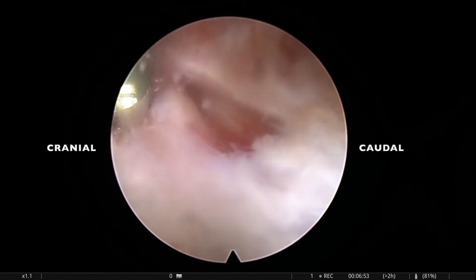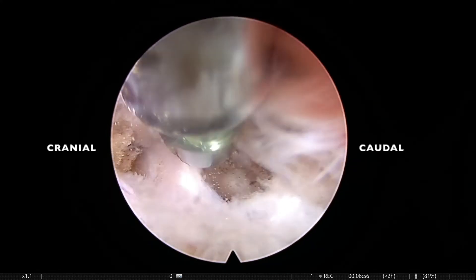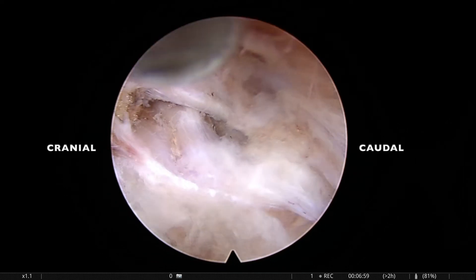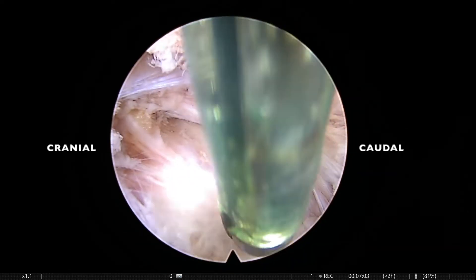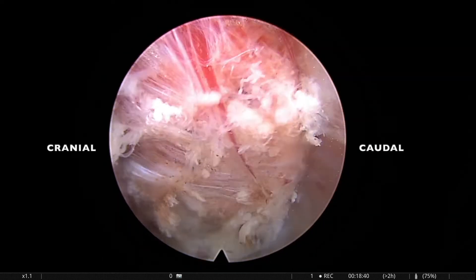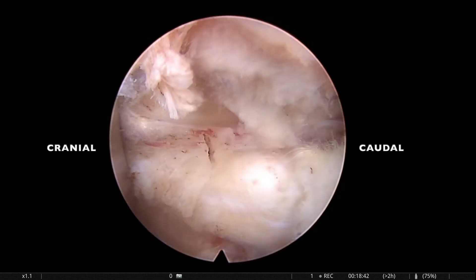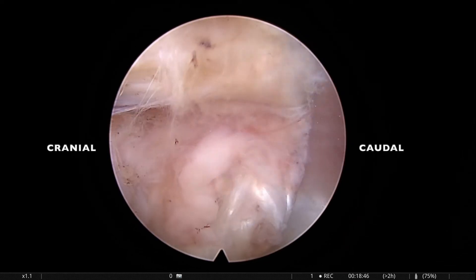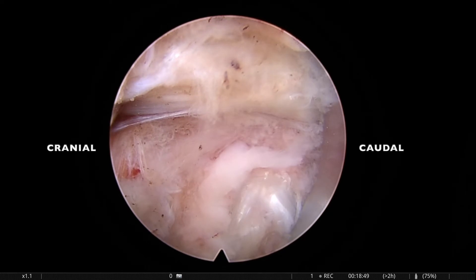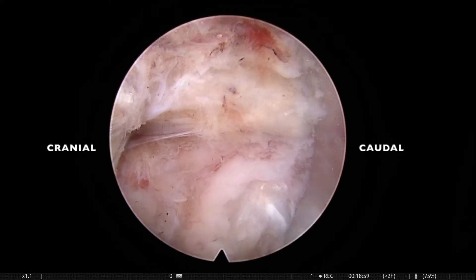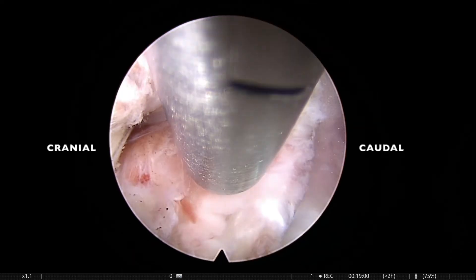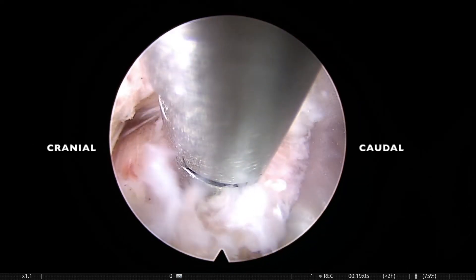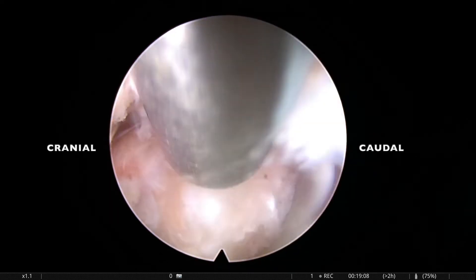After hemostasis using either a dissector or a hook, further fragments are searched. To orient ourselves, the exiting root is between the 9 o'clock and 6 o'clock positions. Some fragments are still seen just below the annular fibers, so residual fragments are removed and any loose fragments intradiscally are also removed.